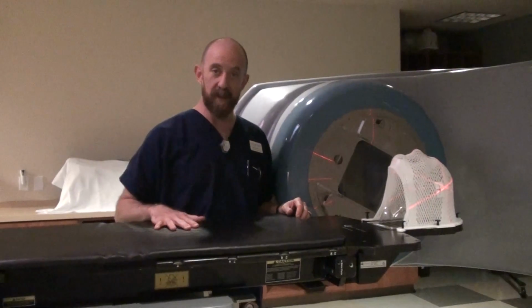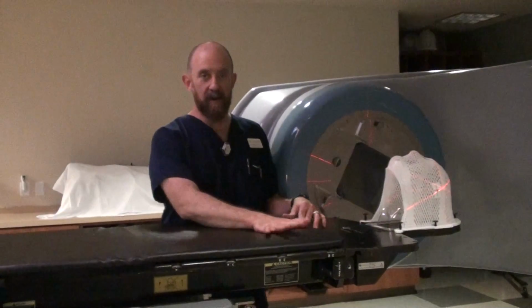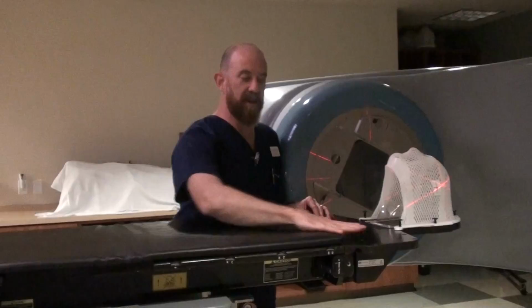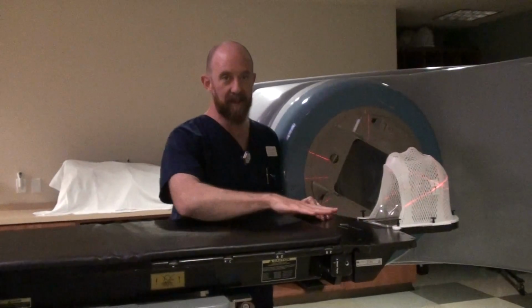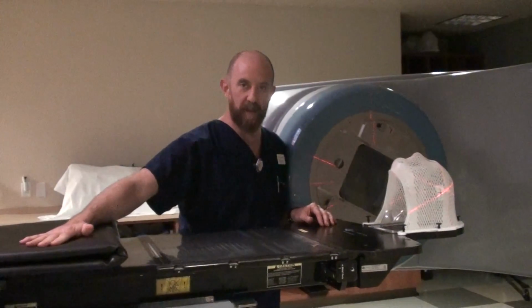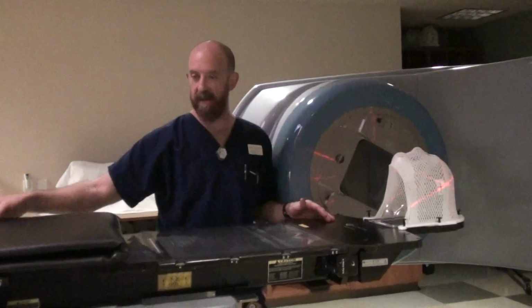When we get to head and neck, we'll talk about this again, but we typically don't necessarily use the table pad for head and neck because the masks are longer and it can interfere with the fit of the mask in the chest even more. In some cases, you can have, say, a table pad under their hips, but not up here under their chest. That's for another lecture at another time.